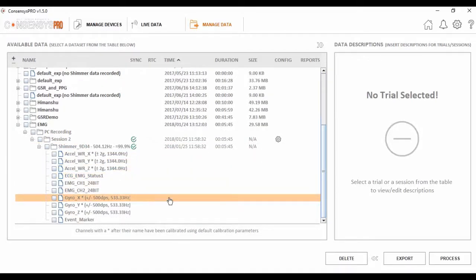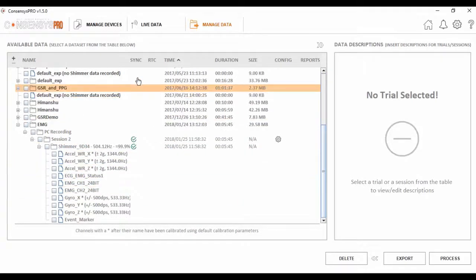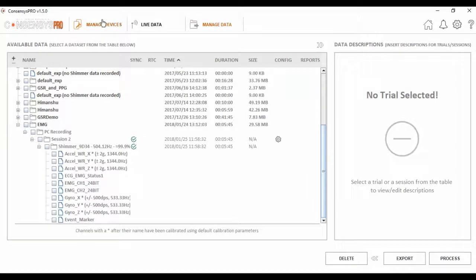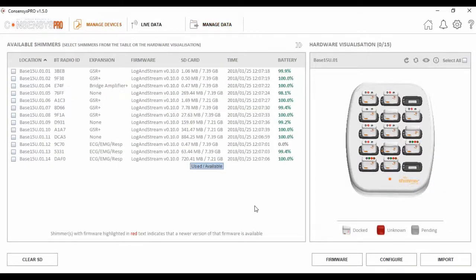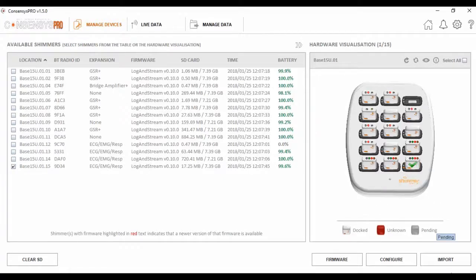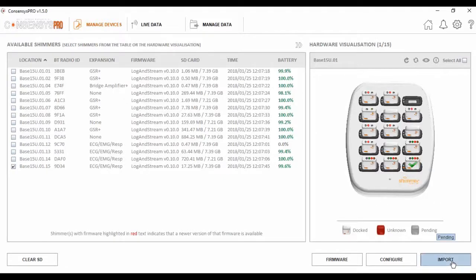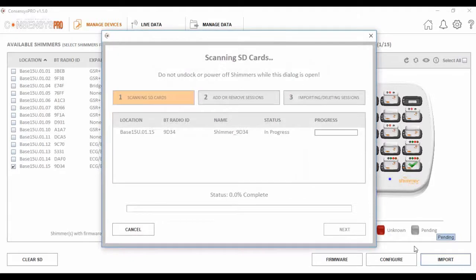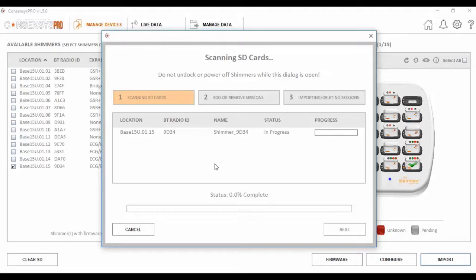The next step is to import the log data from the unit's SD cards. I'll now place the units back in the Consensus Base. I'll select the unit in question, and select the import button. This process is pretty straightforward and intuitive. The software starts by reading the unit's SD card, and then presents you with the data available to import.